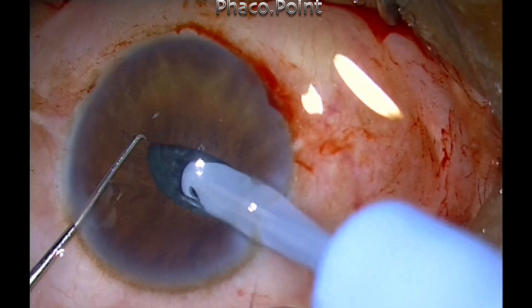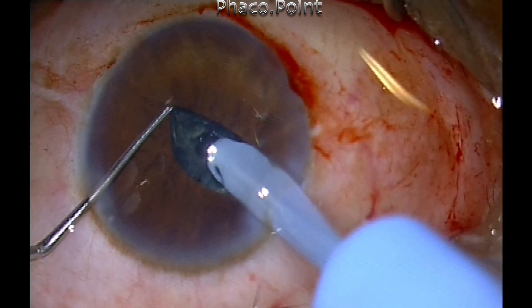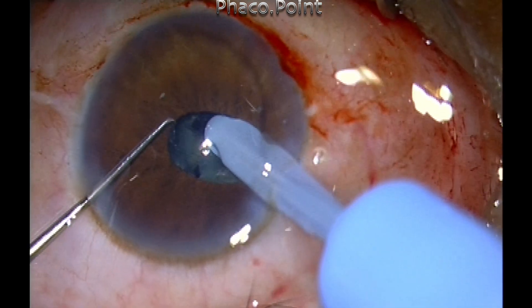With the Sinski hook I gently retract the iris. I'm using the phaco probe — it goes slightly to the periphery — but this is only vacuum; I'm not giving phaco power at all.